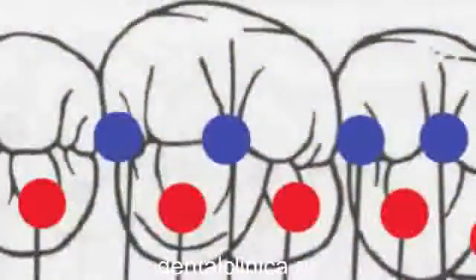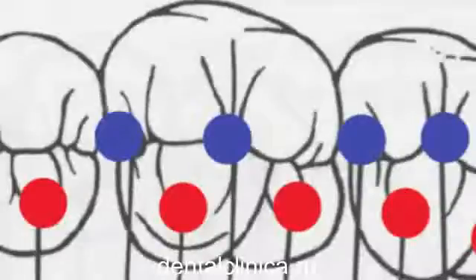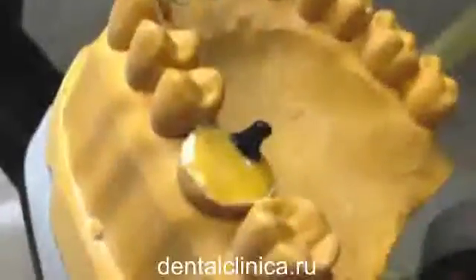Pictured here is a maxillary first molar. The blue represents the receiving areas, and the red represents the stamp cusps. This will serve as a reference when waxing the first molar.